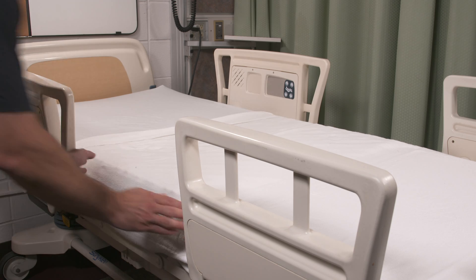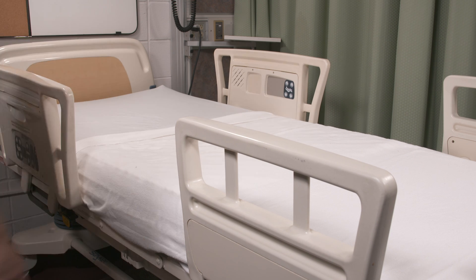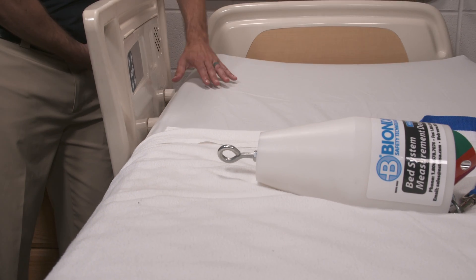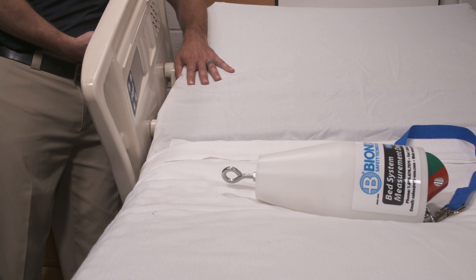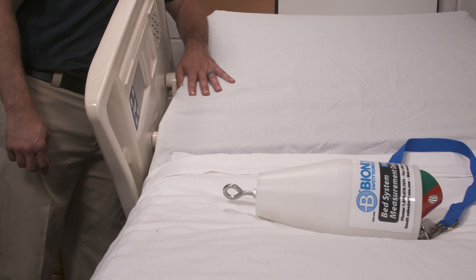Next, firmly push the mattress away from the rail being measured. Raise and lower the head and foot sections of the bed. This will determine the position where the space between the bottom of the rail and the top of the mattress is greatest.